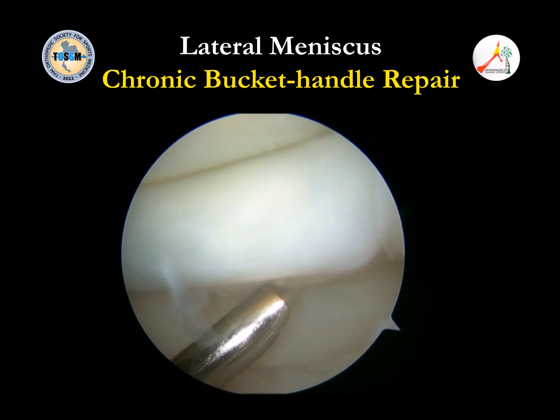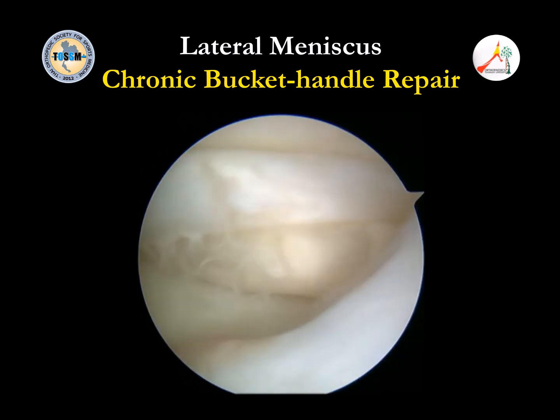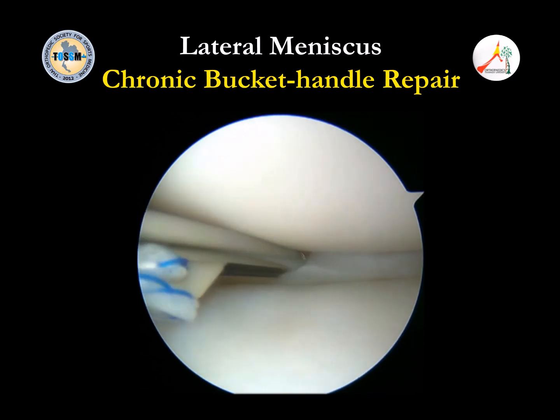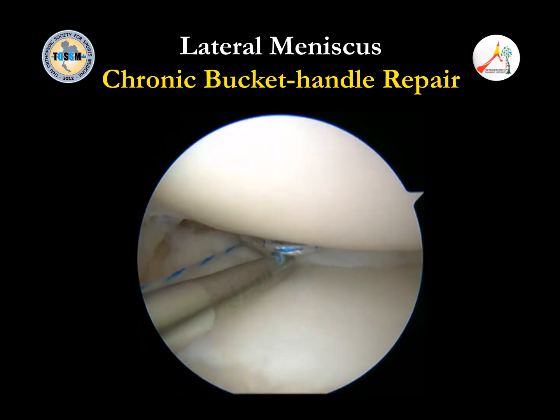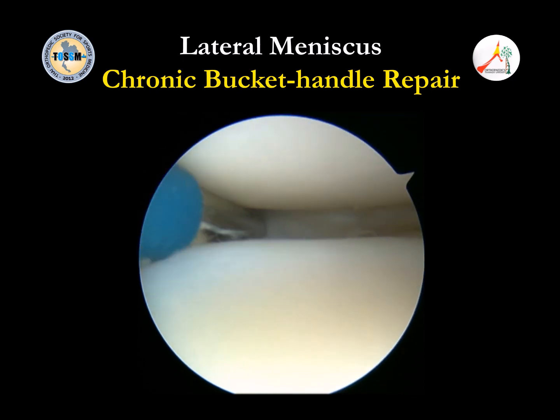After you pull, ask your assistant to pull the suture, and then you slowly go inside out. Now I have four stitches already, and then you start to do all inside in the back. After you reduce the meniscus, do not do all inside fixation at the beginning, because we have a gap between the meniscus and the capsule.